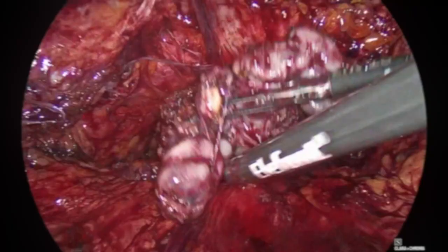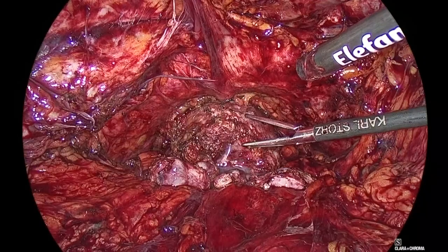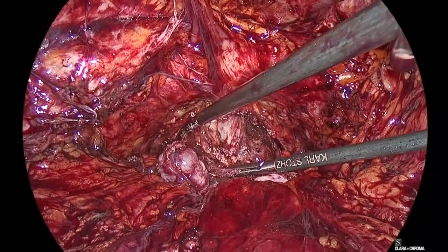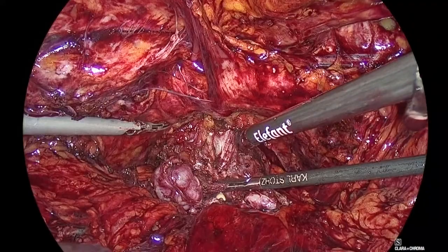Good, now we go for the upper part. Dissection of the apex. Good, is the Santorini suture ready? Okay, grasp the prostate, Panayuti. Good, give me length. Good, harmonic scalpel, please. So in the original description, if Stoltenberg would have dissected the apex early and sutured early? You will see now. I'll try to make it as thin as possible. Give me a strong grasper. As thin as possible, and then put the Santorini suture in.